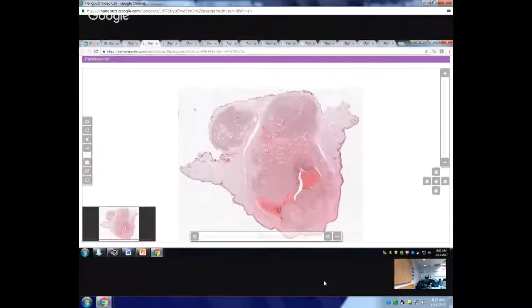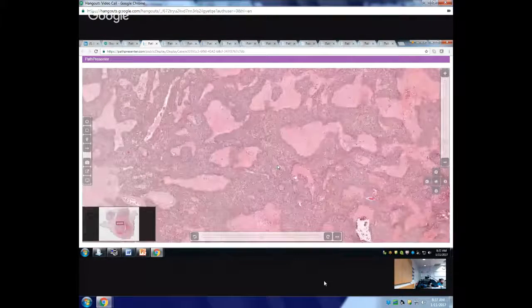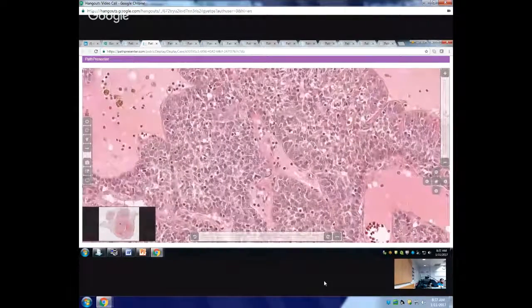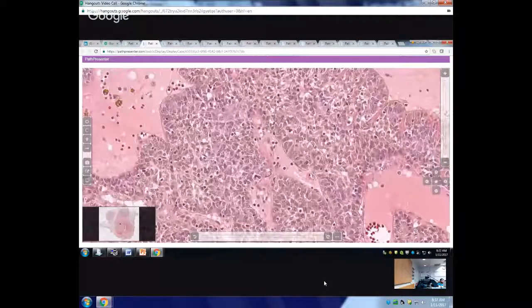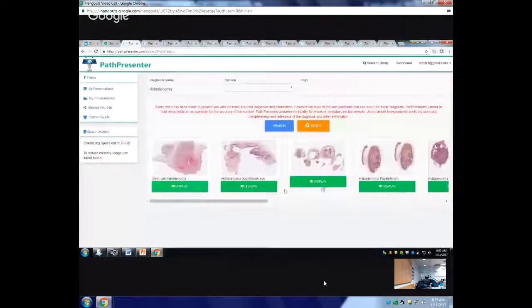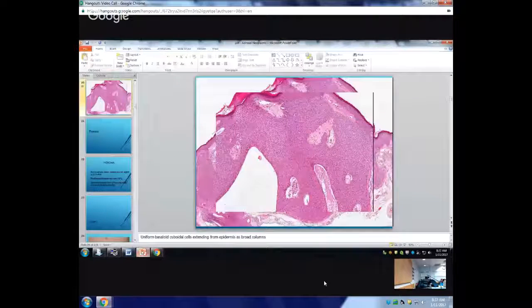Both are eccrine neoplasms. One is arising from the top part of the eccrine duct, and the other is arising from the lower part of the eccrine duct. So they are arising from the same structure, so they can look very similar actually. But the stroma in a poroma always contains a lot of blood vessels, and the stroma within a hidradenoma contains a lot of sclerotic structures actually. Let's look at another one. And cell morphology, is there a difference? Cell morphology is also different. So I'll show you about this. So let's go to this.